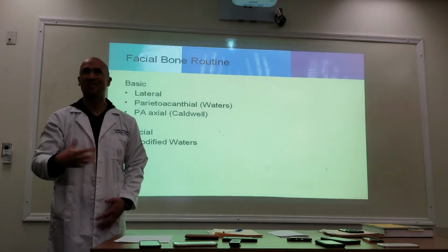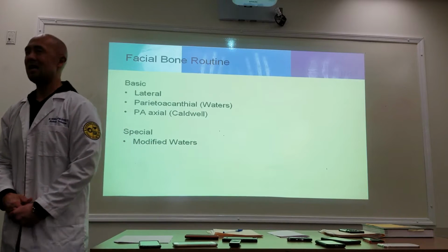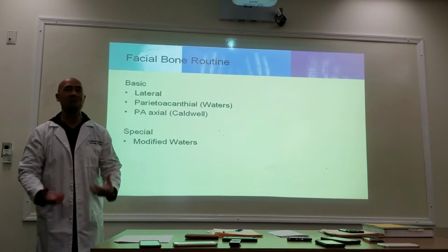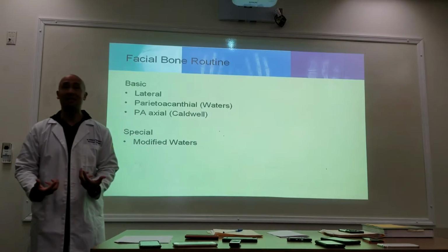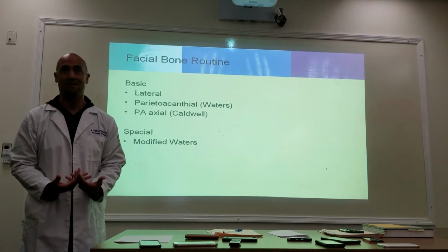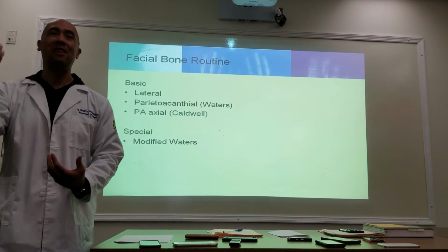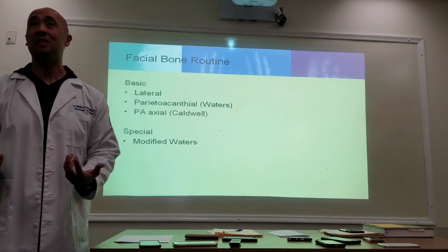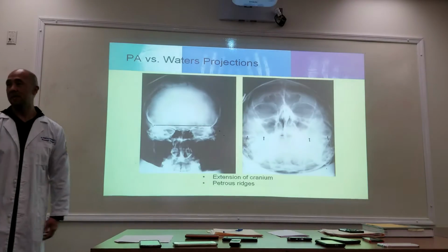That's the only difference. So it sounds like there's a lot of views, but they're repetitive. Okay? And that should help alleviate some of the stress, because there really isn't a lot of views. They're the same views and projections. So if you can get that ingrained in your head, they're the same. What makes a difference is the central ray. All right, so let's begin.